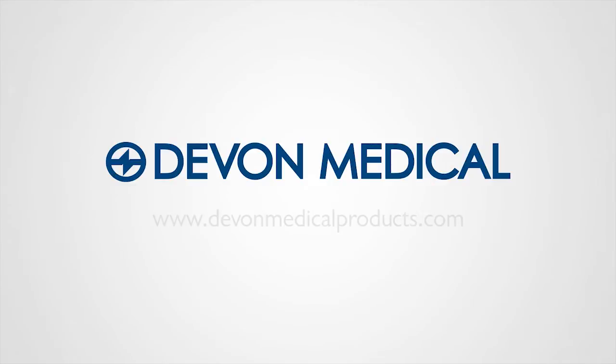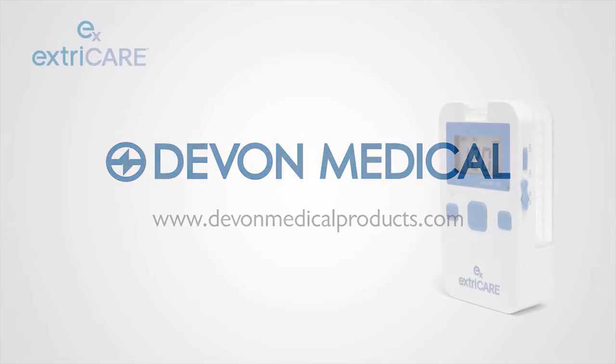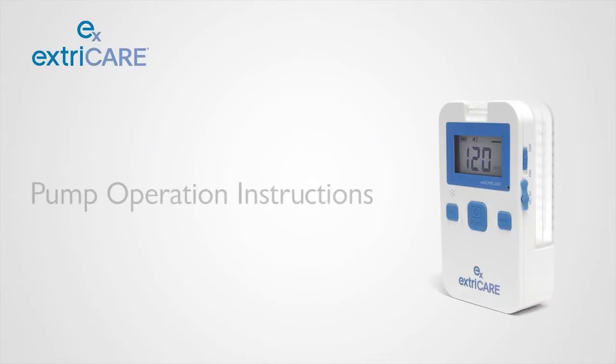The extriCARE Negative Pressure Wound Therapy System is used by healthcare professionals and caregivers to help treat non-healing wounds. This instructional video will demonstrate pump operation and situations that could cause alarms to sound.